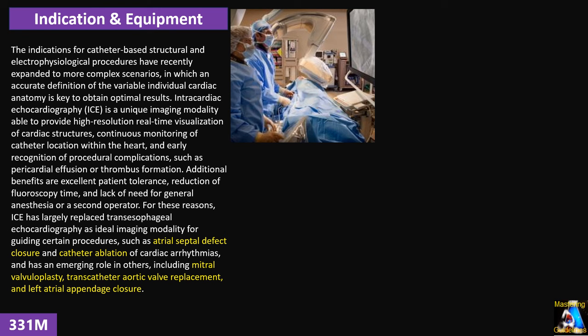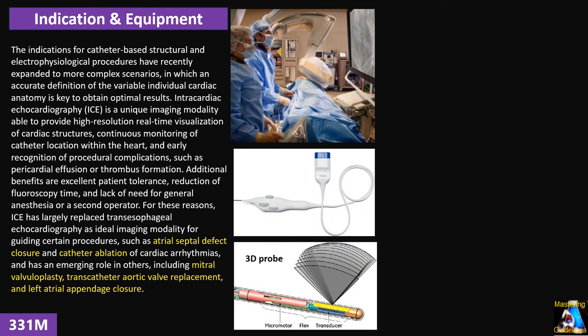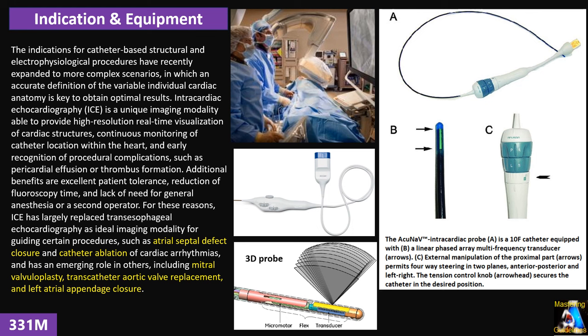Nowadays, many center cardiologists and interventionalists are very familiar with it and use it a lot. There are many different types of machines and probes for ICE. The general concept in all of them is the same; only the knob and control panel handle are a little different, but the concept among them is the same.